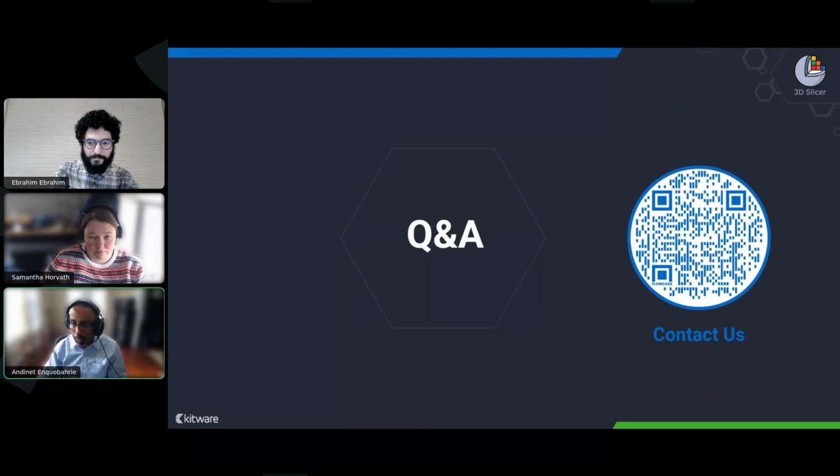One question came in, and this is for you, Ebrahim, about the OpenWater module. The question is that it's a module freely available that anybody can use, and how customizable is it? Yes, it's open source, freely available.